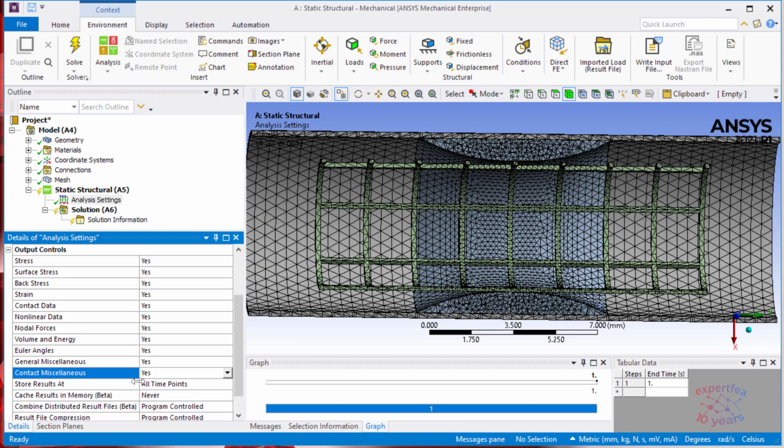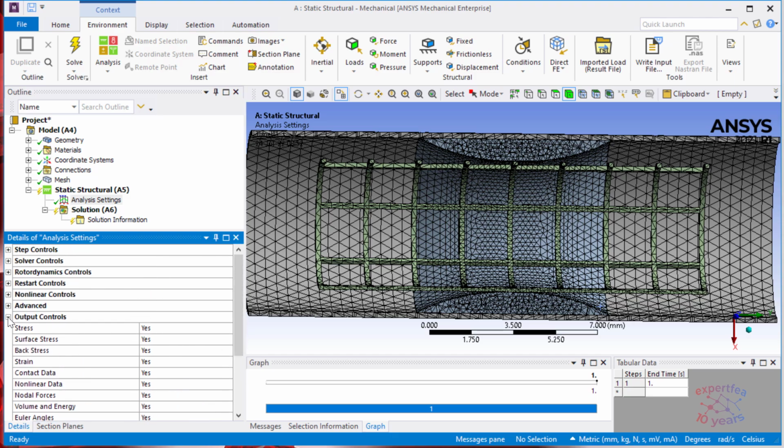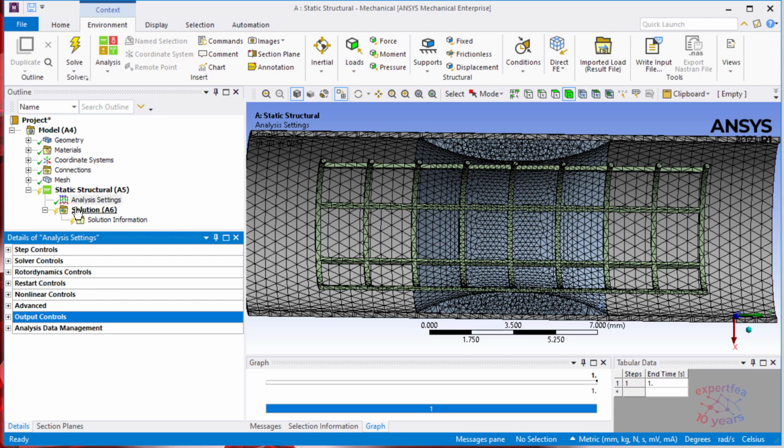We're interested in the force reaction inside between these parts, so this is why we made everything visible here. So let's apply the boundary conditions.